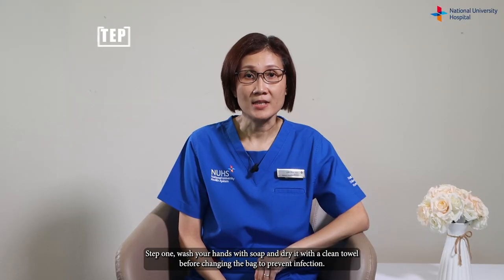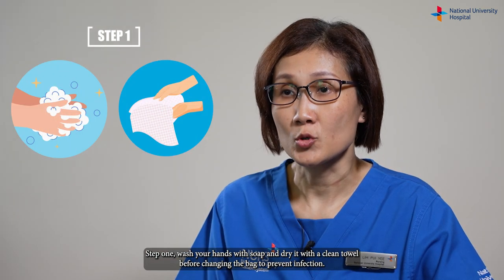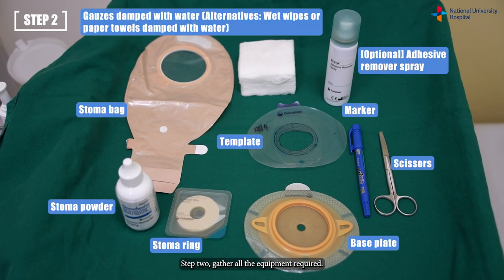Step one: wash your hands with soap and dry with a clean towel before changing the bag to prevent infection. Step two: gather all the equipment required.